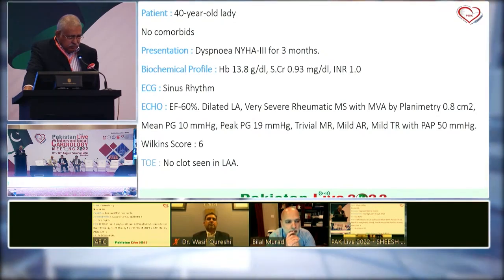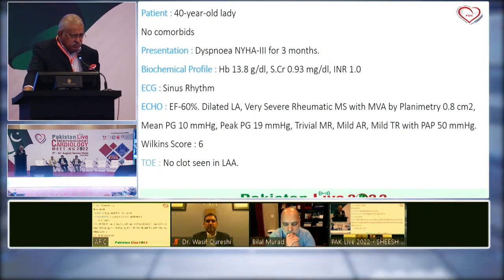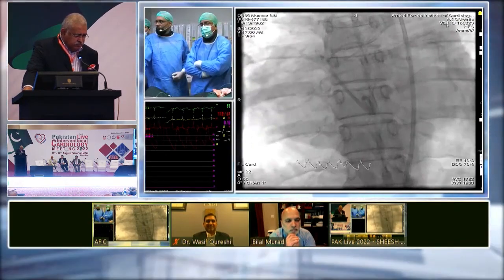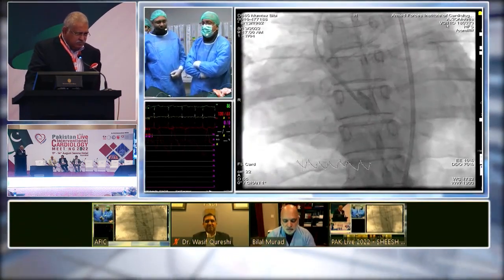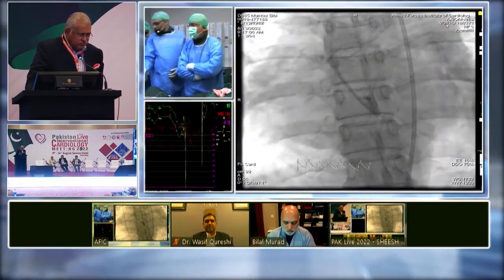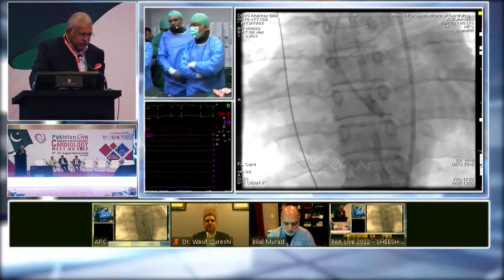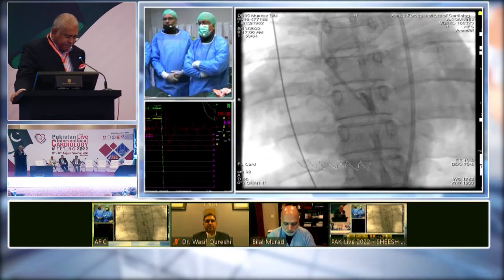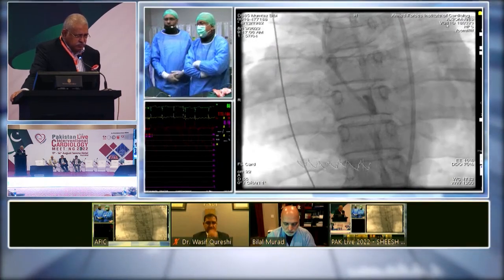Actually, we're told that we're going to go offline at 9:45. So we waited till about 10 minutes ago, and then we decided that you were having such a healthy discussion on the TAVI, and of course PTMC is like the poor man's intervention, so we thought you wouldn't give us enough time, and because we had the lines in and we didn't give the patient any heparin, we went in. It didn't take us long, about 6-7 minutes, but if you want, we can show you the steps we saved on the floor. The procedure itself is just a routine, healthy activity.